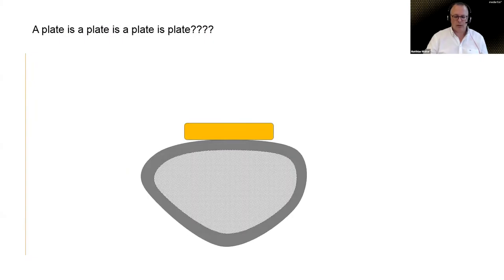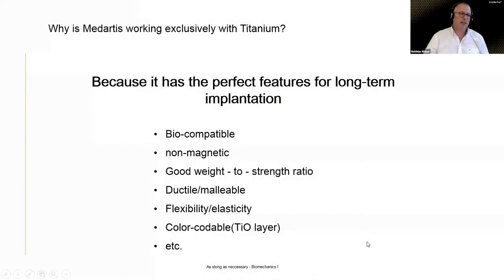No, certainly not. They come in all shapes and sizes. They come big, small, with big cross-sectional area. Sometimes they have two arms that cross the fracture. And all those things obviously have a certain meaning for us. And we have to understand that, due to the design, they also behave a little bit differently when it comes to testing, for instance.